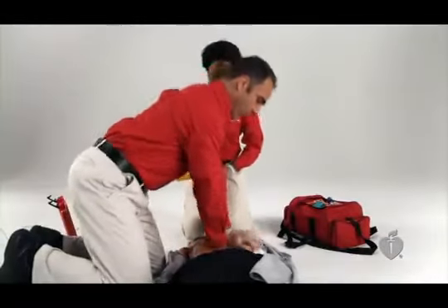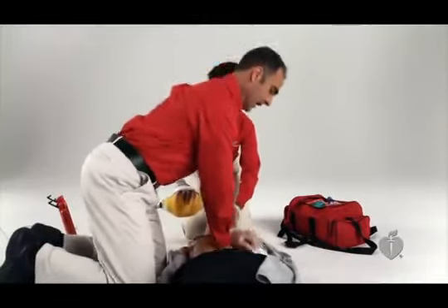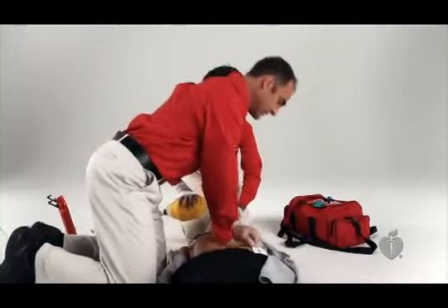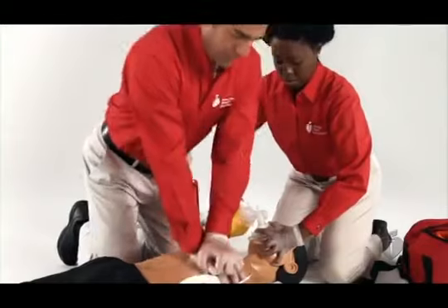The shock may produce a sudden contraction of the victim's muscles. As soon as the AED gives the shock, immediately resume CPR, beginning with chest compressions. Do not remove the AED or turn it off. The AED will repeat the analyze and shock cycle every 2 minutes. When the AED indicates no shock advised, you do not check the pulse first, you immediately start chest compressions again. There are also some special situations you'll need to consider when using an AED.